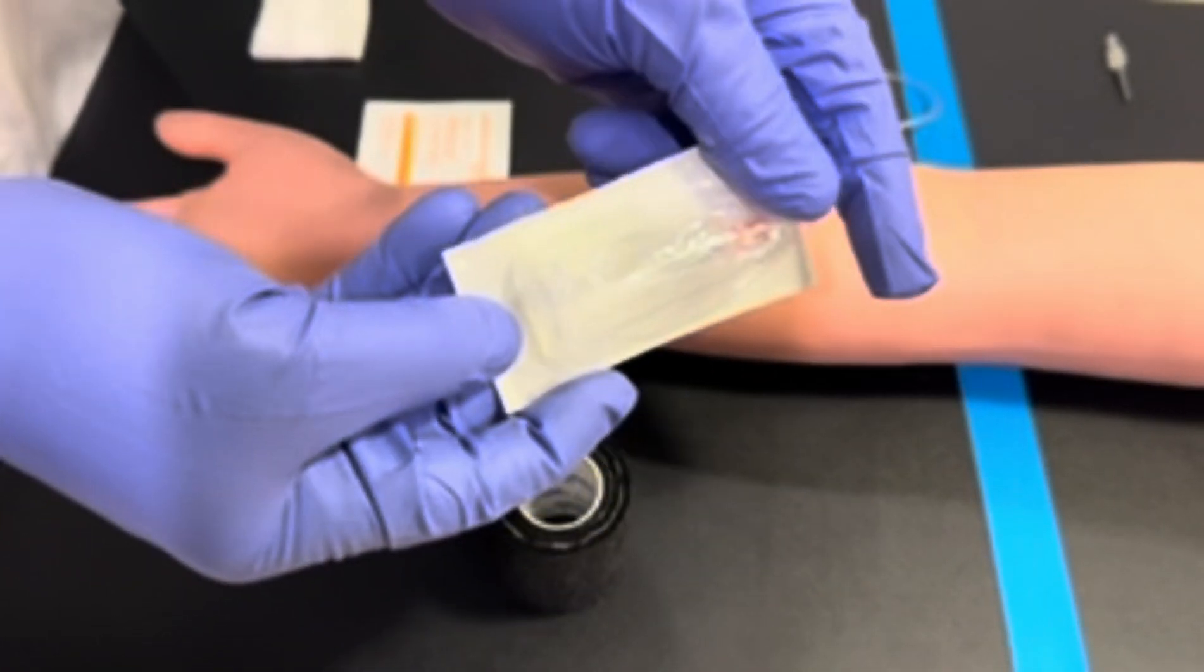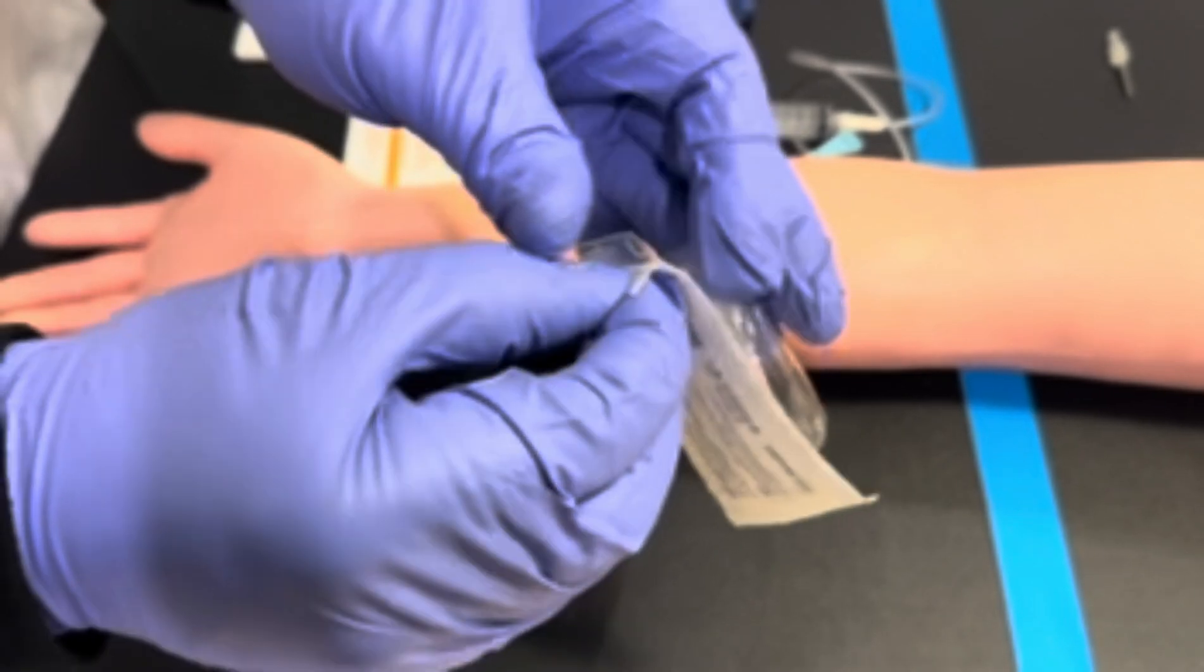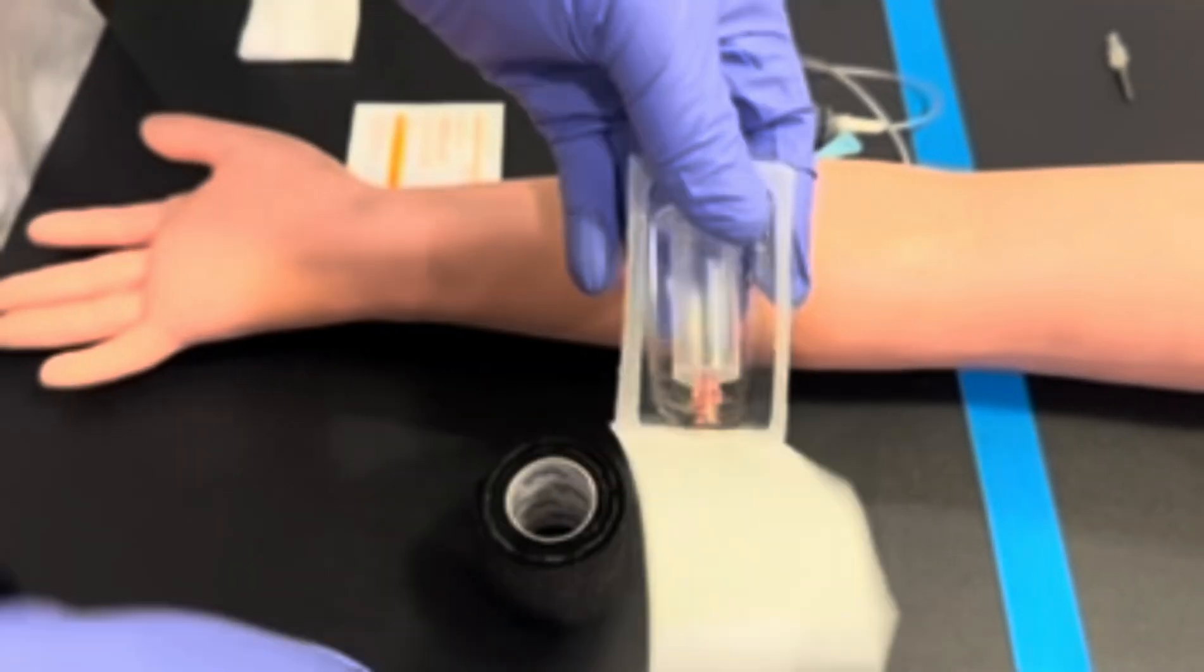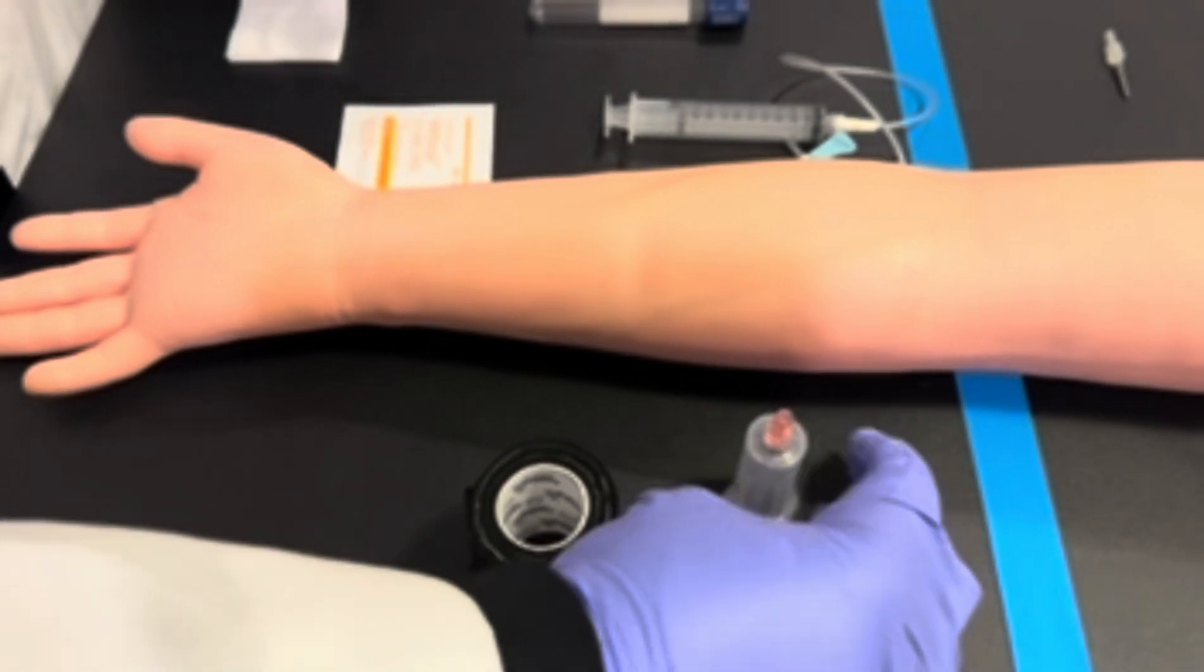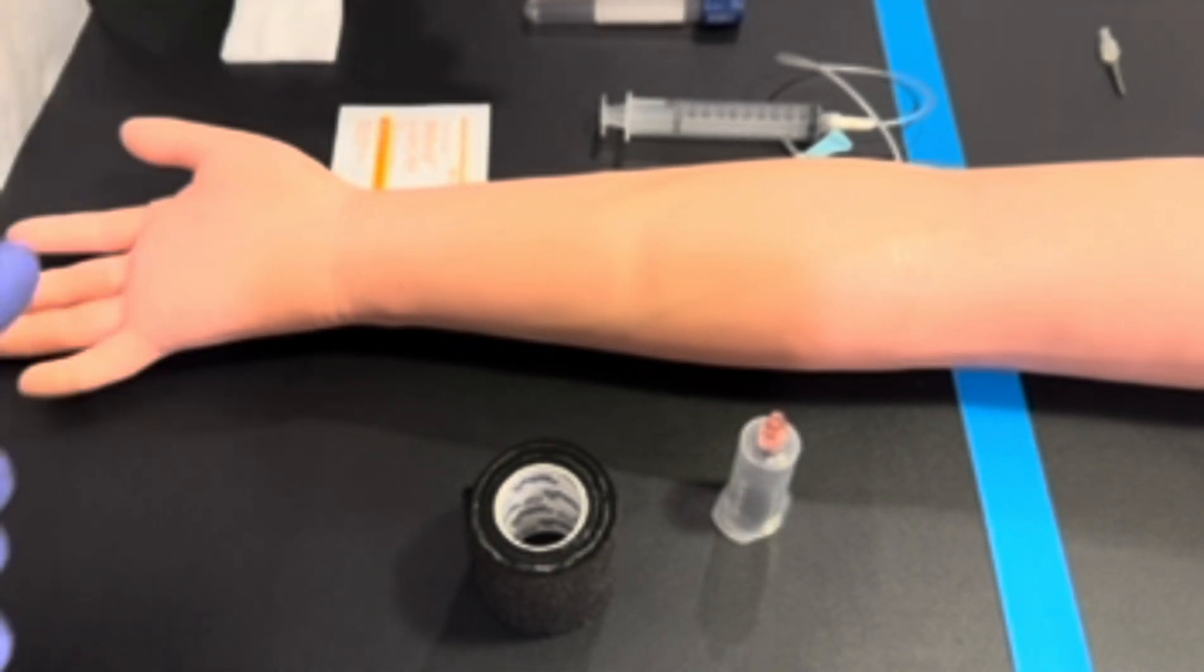We will use a transfer device to transfer the blood from the syringe into our vacutainer tube after successfully performing the venipuncture.